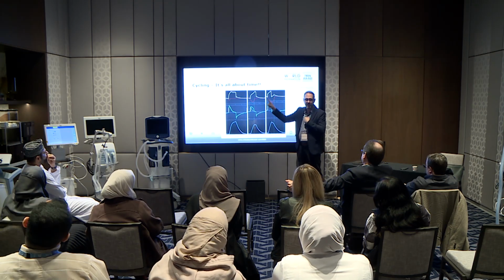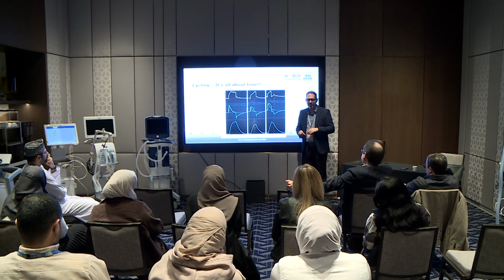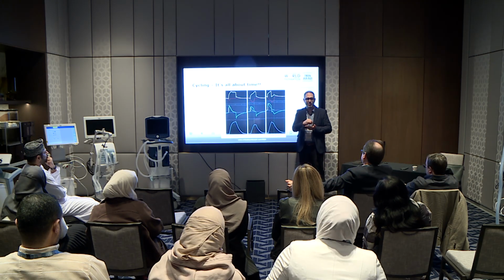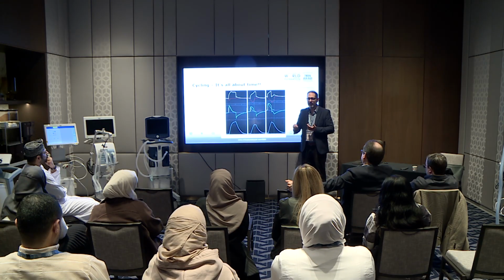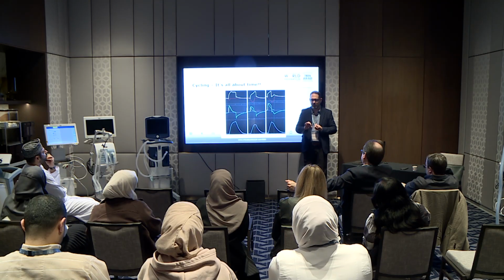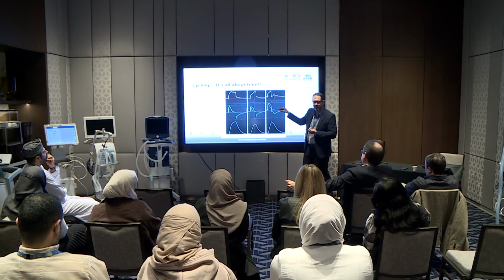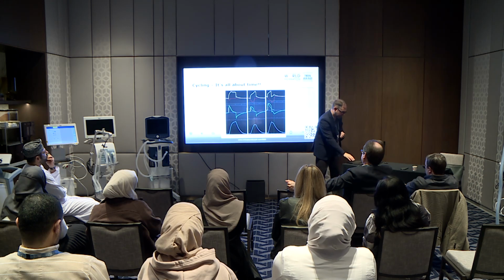We control the timing. Even in pressure support, people say there's no I time. They go, oh, the patient does what they want. No, the ventilator cycles off at a set time, not time, but at a set point. And usually it's something like 25% of peak flow. But that's a setting we can adjust. I would argue most RTs don't know that they should adjust that in some patients. And in some patients it's more important to adjust it than others. So the blunting there, you can all see how PMUS impacts it, right? When the breath goes on beyond, you see this, and we're going to have a couple of different examples with that.